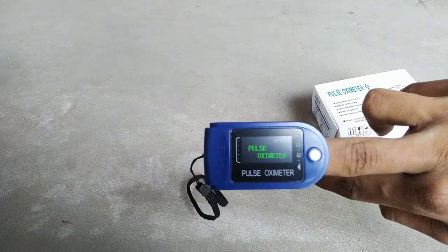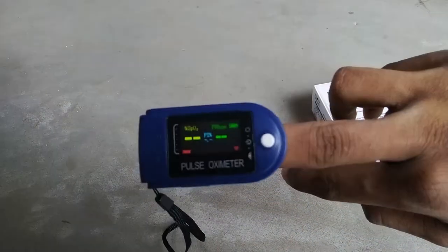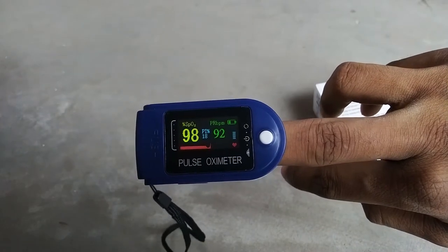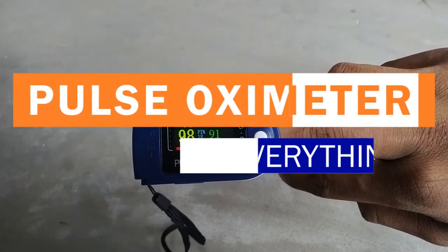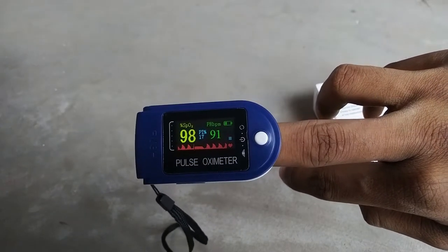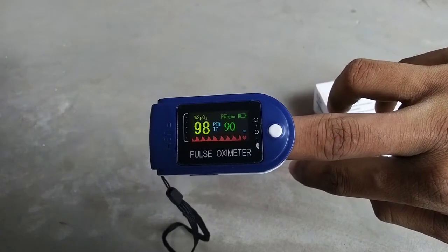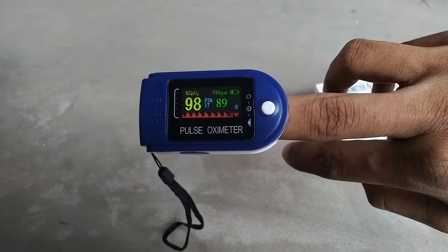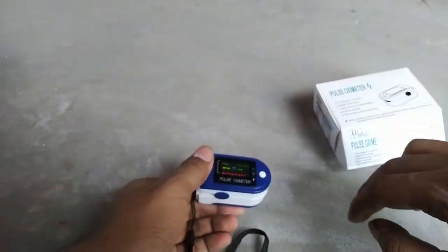Due to the COVID-19 outbreak, pulse oximeter is now a very important gadget in our daily life. In this video, I am going to talk about everything about pulse oximeters — how it works, how it detects our oxygen saturation level, how we can choose the best pulse oximeter online, and how we can detect which pulse oximeter is fake and which is genuine. Without further delay, let's get started.